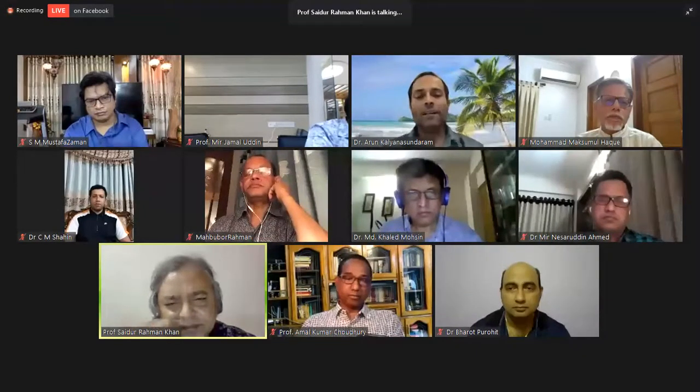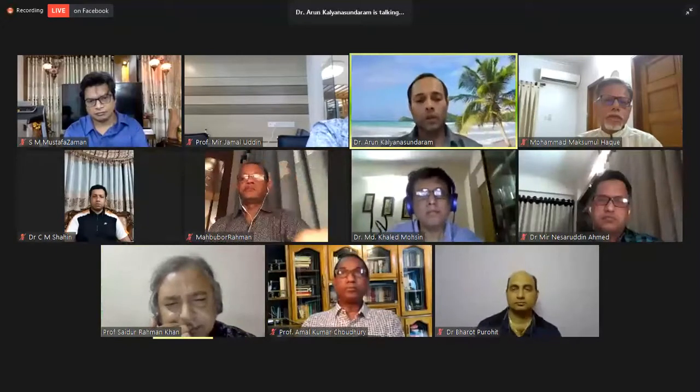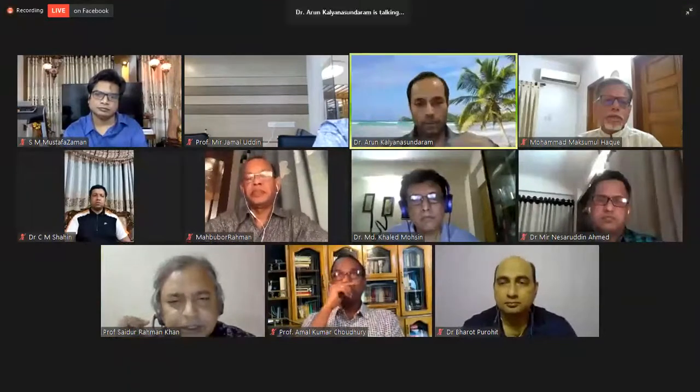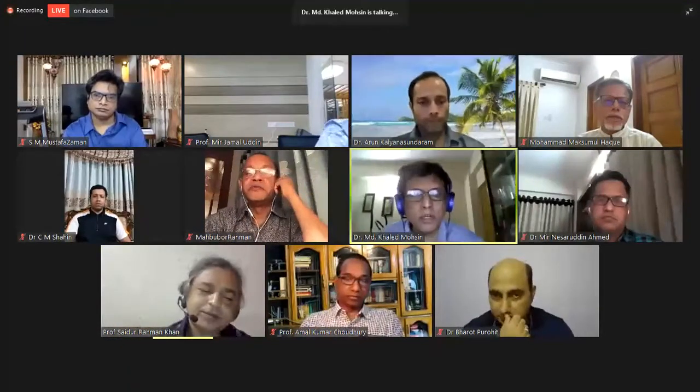But that's not your start. You don't want to start learning how to knuckle with Gaia first. Yeah. Go for an XT. It knuckles a lot easier. Yeah. Okay, thank you. Thank you, guys.